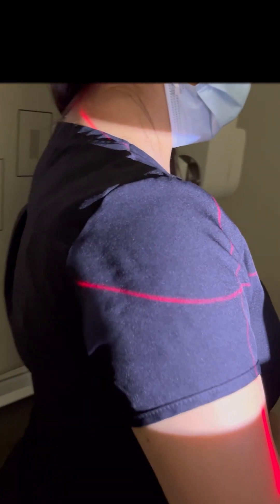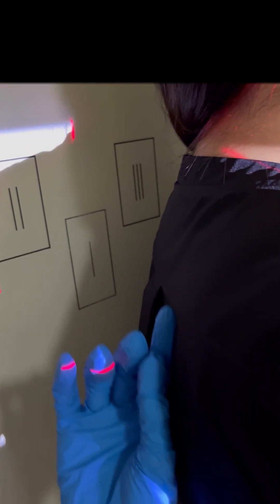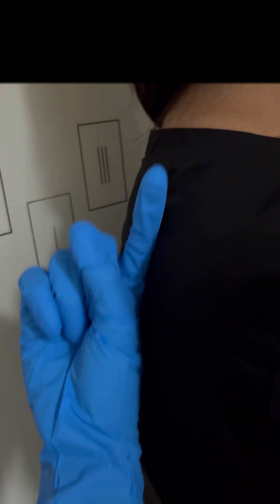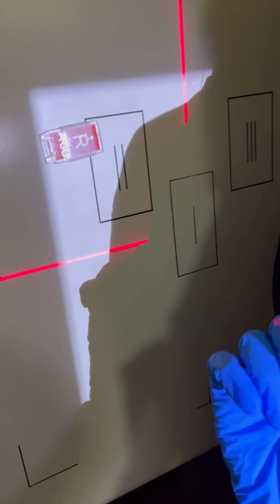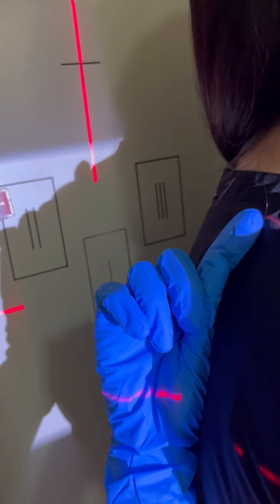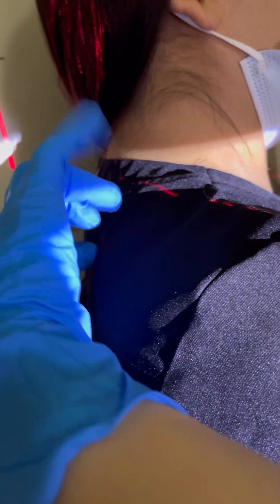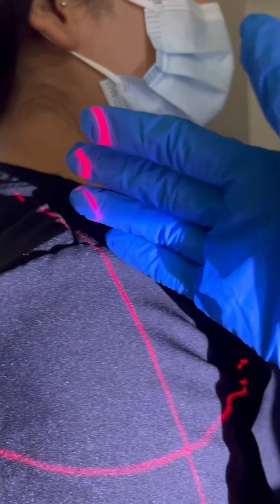You want to feel for the back of the scapula. This is really hard to do with just one hand. The back of the scapula should line up with the crosshair, and then you want your humerus to be in the center. You want there to be a nice line between the back of the scapula and the front part of the humerus.